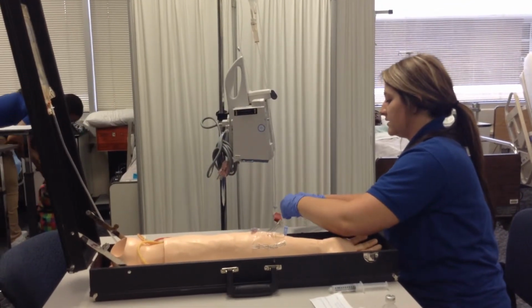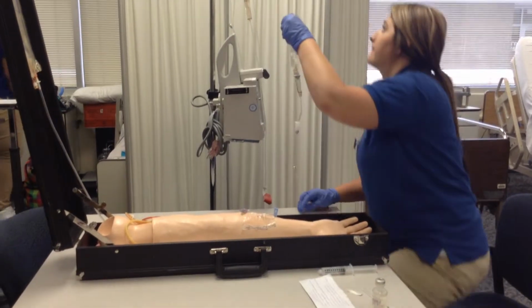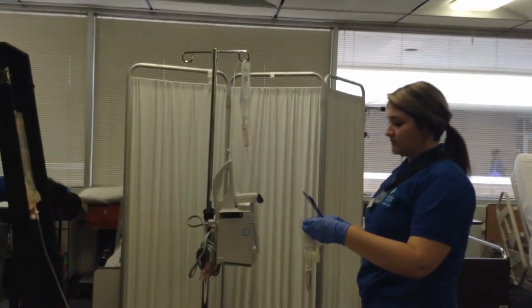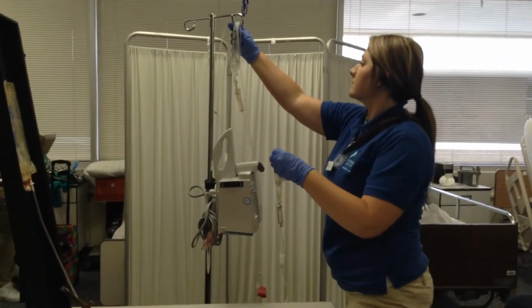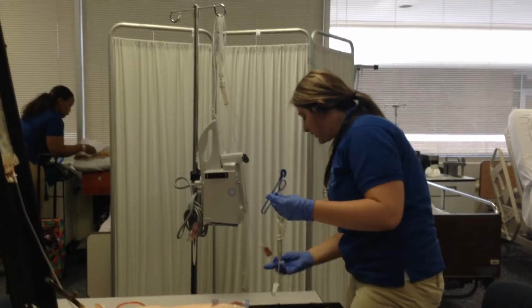Making sure that this is clean. I have clamped my primary tubing.